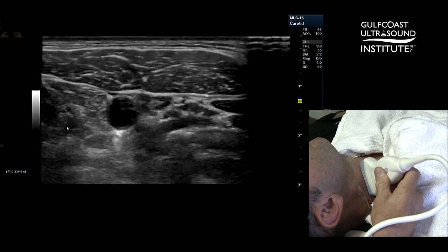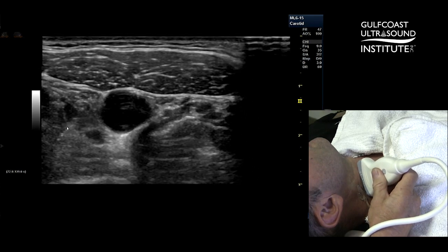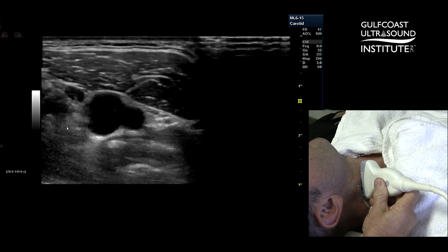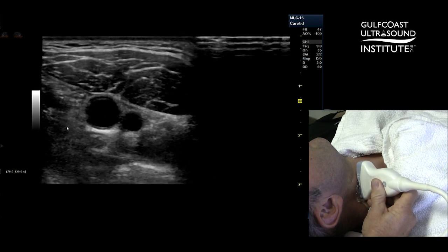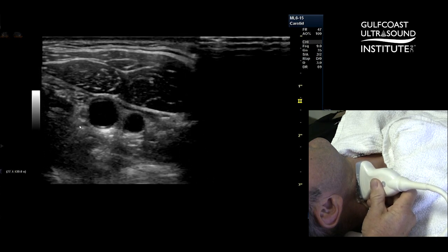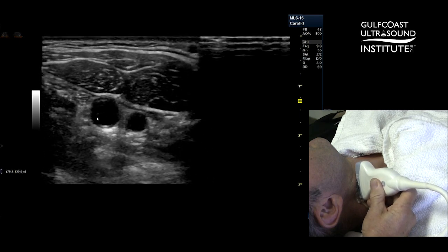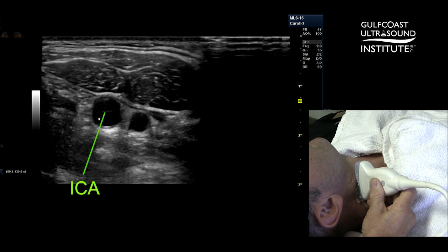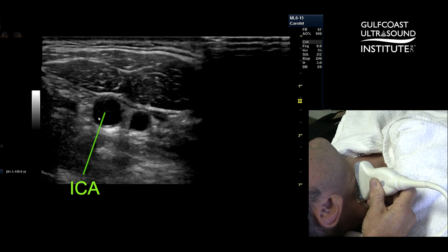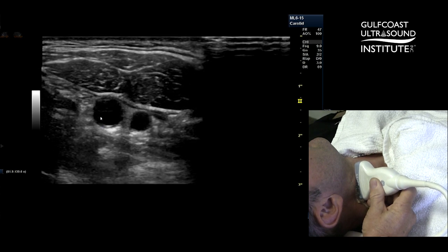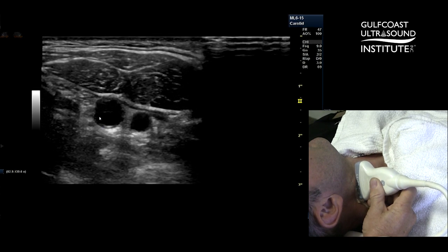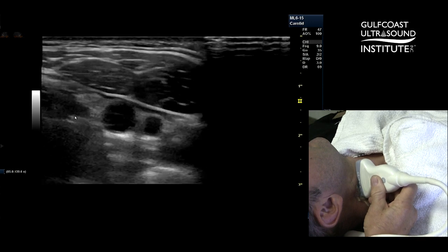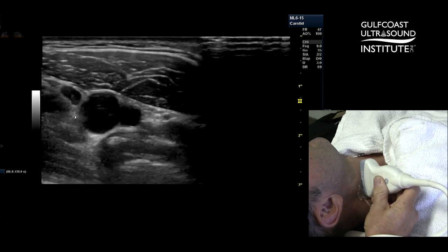So as we scan up the neck, we come to the bifurcation region, and then we see the bifurcation. I know that that's the internal carotid artery not because of its size, but because of its posterior position within the neck.